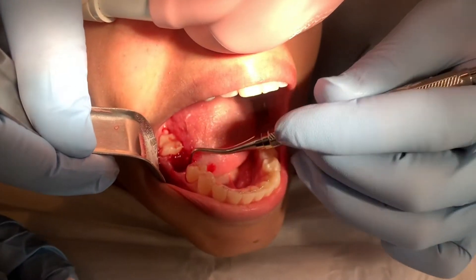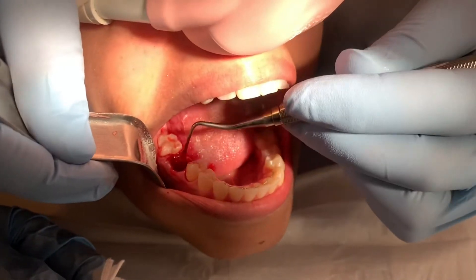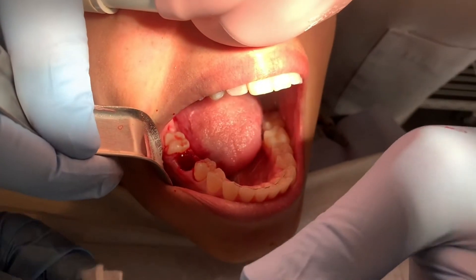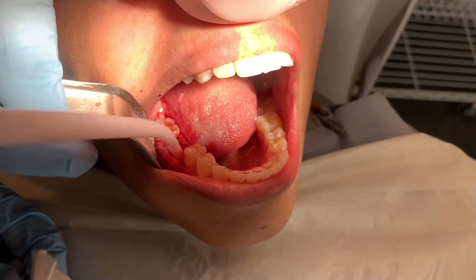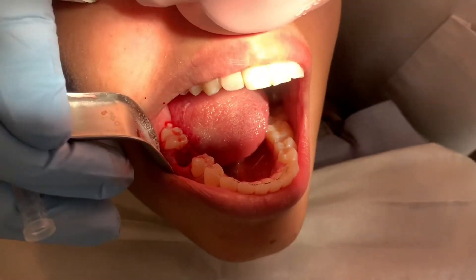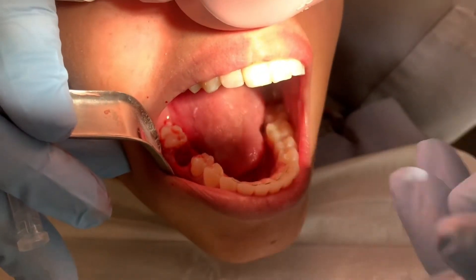There's not any scar tissue or cysts at the bottom of this area — that's much more common in root canal extractions. I have a video called 'How to Properly Clean a Root Canal Tooth' that you can watch. There's a lot more going on with those teeth.